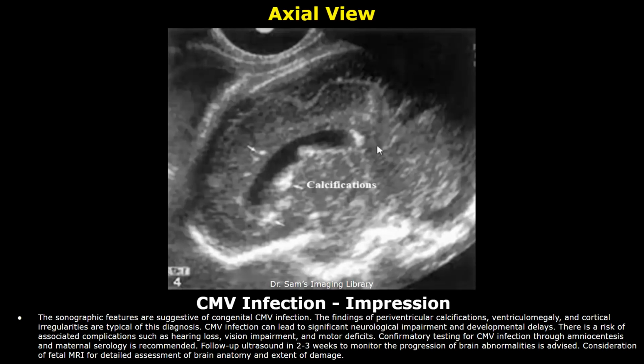Confirmatory tests for CMV infection through amniocentesis and maternal serology are recommended. Follow-up ultrasound in 2 to 3 weeks to monitor the progression of brain abnormalities is advised. Consideration of fetal MRI for detailed assessment of brain anatomy and extent of damage.